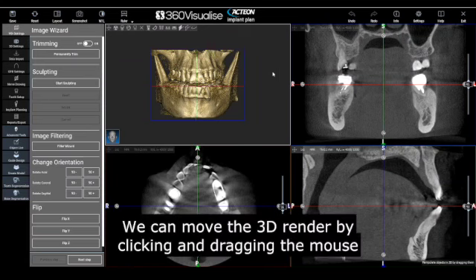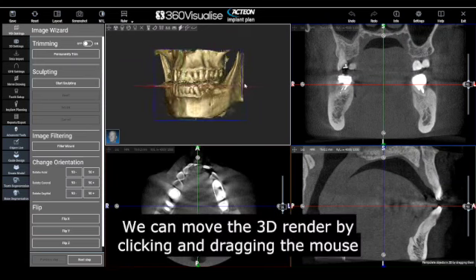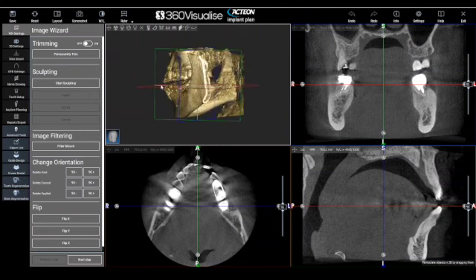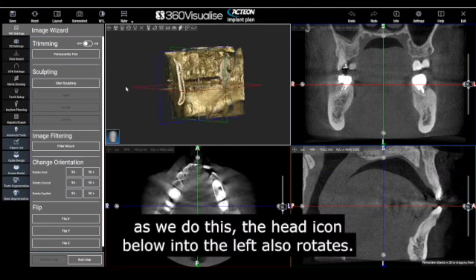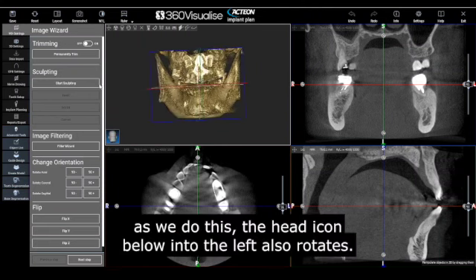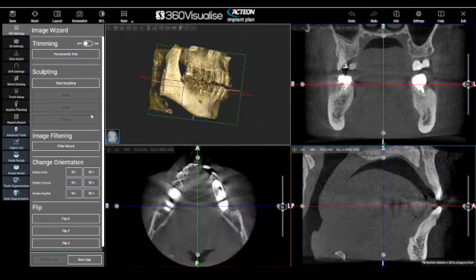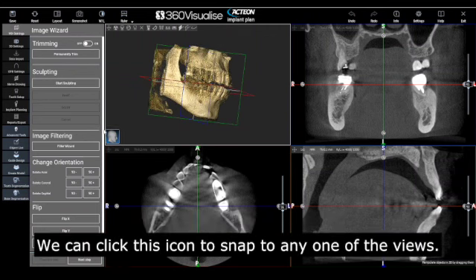We can move the 3D render by clicking and dragging the mouse. As we do this, the head icon below and to the left also rotates. We can click this icon to snap to any one of the views.